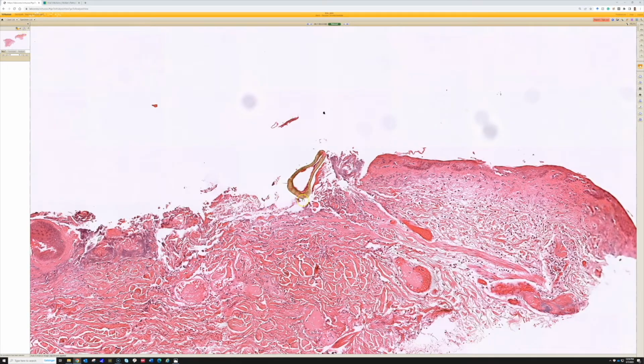And anytime you find a fragment of arthropod, the next step is figuring out what type of arthropod it is. If it's embedded at the site of an arthropod bite reaction, then that's more likely a tick mouthpart. If it's bigger than this and down in a hole, in a cavity in the deep dermis or subcutis, and the patient traveled to Central America, then it's probably a botfly larva. If it's made of arthropod parts and it's a massive lesion in the foot underneath the epidermis, then that might be tungiasis. If it's a small little lesion in the stratum corneum, then that might be a scabies mite.